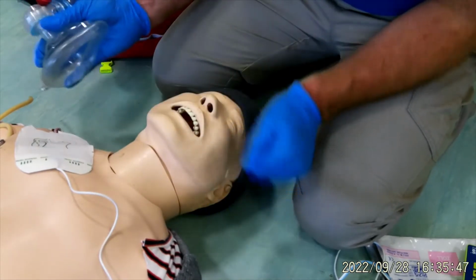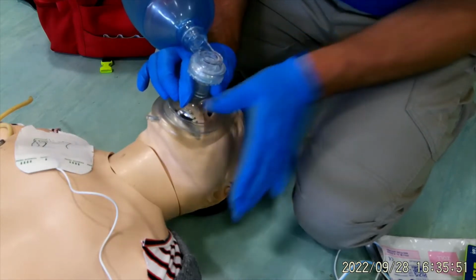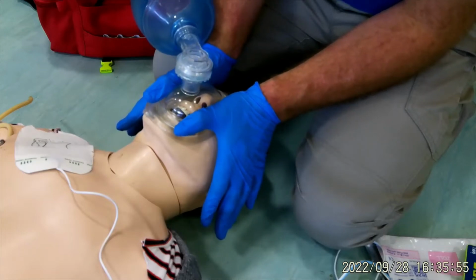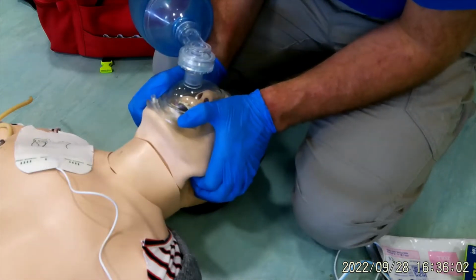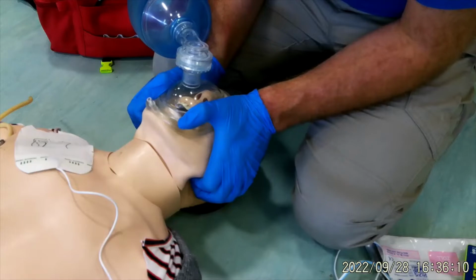So just to go through that again, the pointed bit goes over the nose onto the chin. My thumbs come down the mask pointing towards the patient's toes. My index fingers come to the angles of the jaw and I pull the jaw into the mask. My colleague then would do 30 to 2, so 30 chest compressions followed by 2 ventilations.